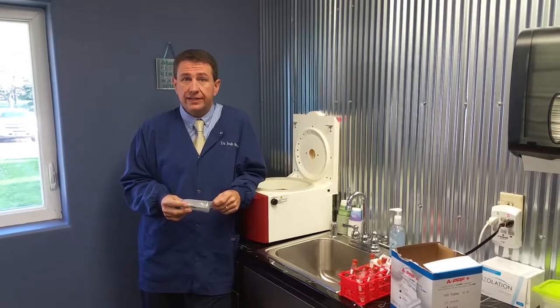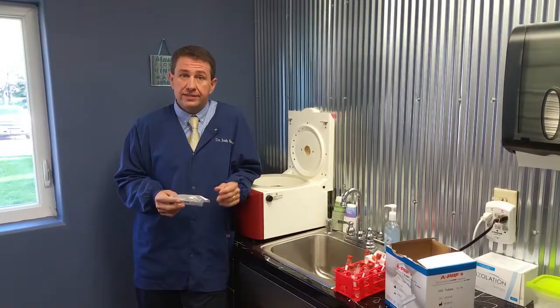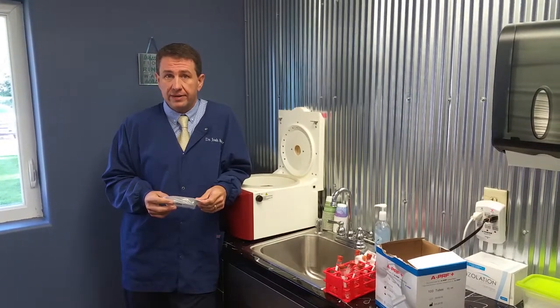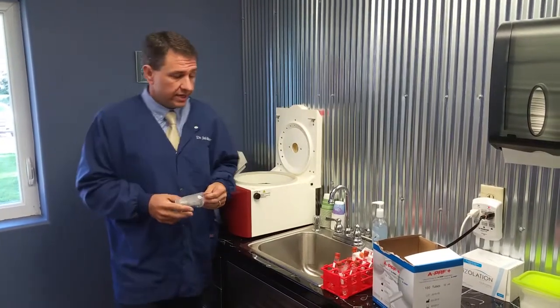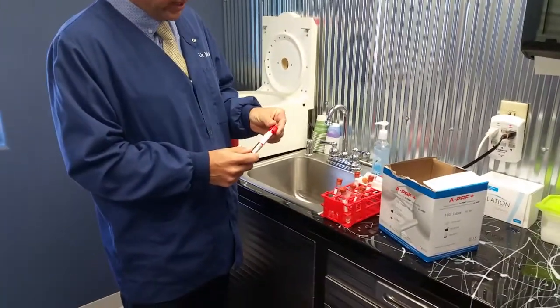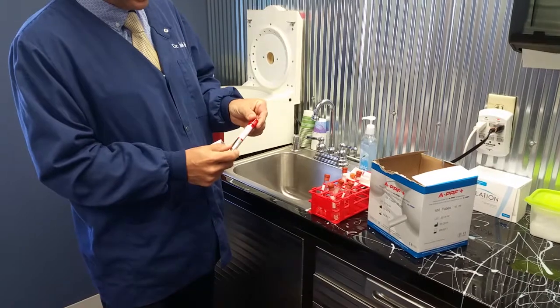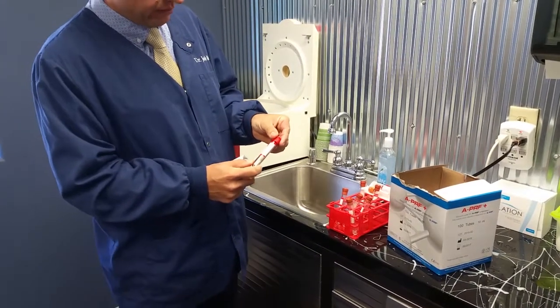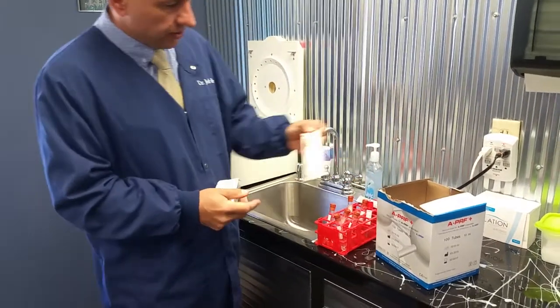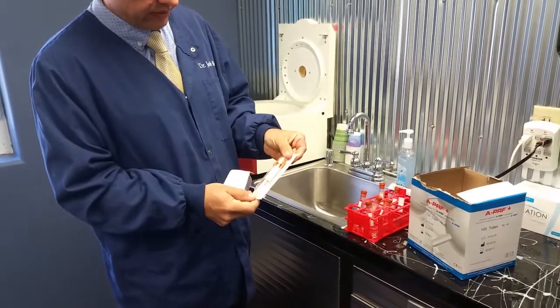Let me explain the difference between APRF and IPRF. APRF is advanced platelet-rich fibrin, and IPRF is injectable platelet-rich fibrin. It's a simple difference. If you look at the tubes, Dr. Shocker has a red tube — this is the regular advanced platelet-rich fibrin, which he basically brought to us here in the States from France. And then he's got an orange tube for injectable platelet-rich fibrin.